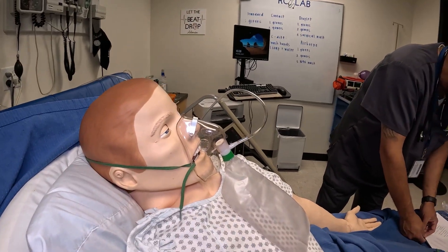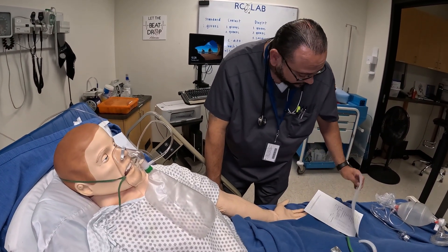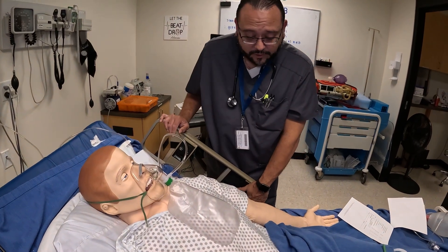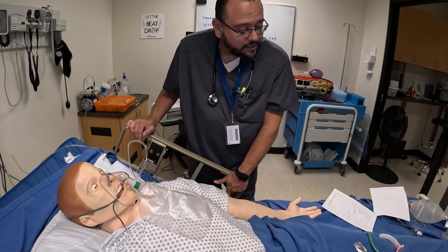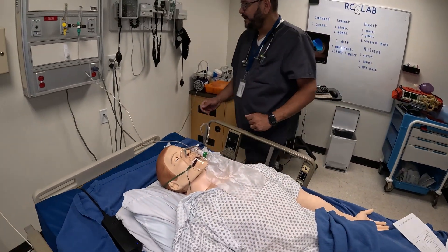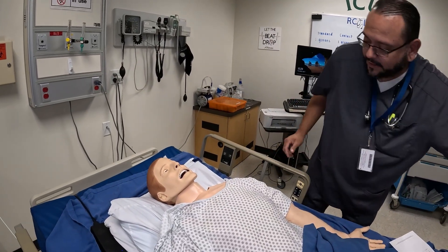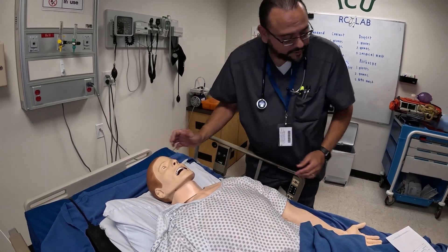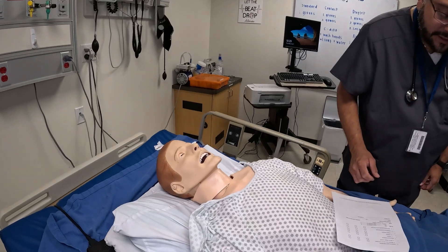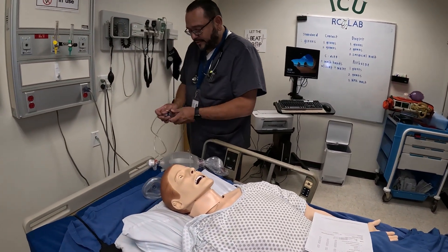Now that we're transitioning from the non-rebreather, we're going to lower the bed and get the other supplies ready. For manual resuscitation with the Ambu bag, you're always going to be at the head of the bed — respiratory should be at the head of the bed. Remove the non-rebreather mask and position the patient's head appropriately, then get the Ambu bag ready.